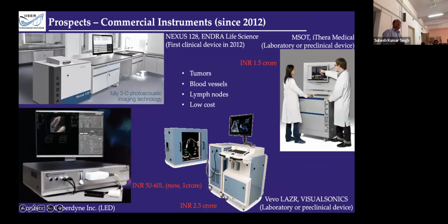From the prospects point of view, I'm just showing a few. Till now, 10 to 12 companies around the globe offer photoacoustic imaging systems in the market. Just to clarify, these are imaging systems for laboratory use, not for clinical use. Why? It is not because of the technology, it is because of ethical approval. The good news is that in the last 1 or 2 years, it has been approved for breast cancer diagnosis. So we believe that in the near future, in these 2 or 3 years, it will be rolled out for clinical applications.